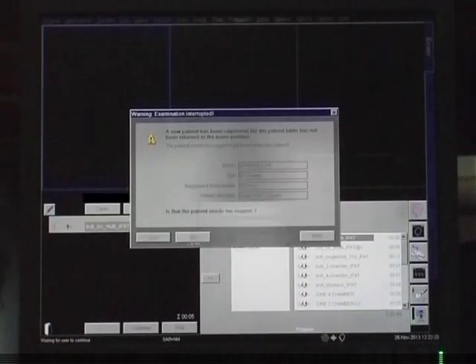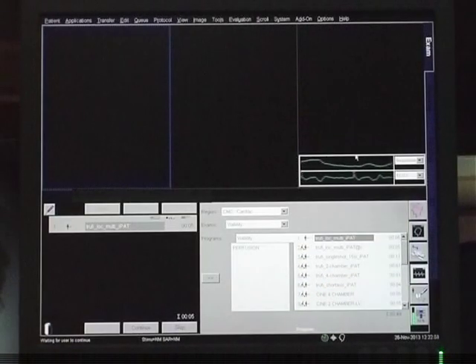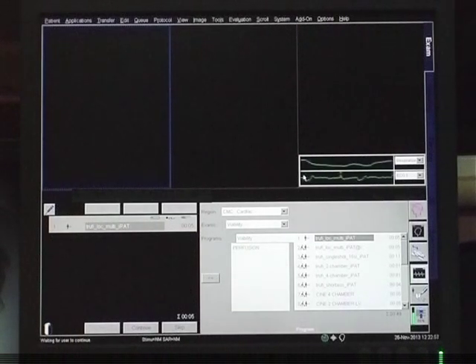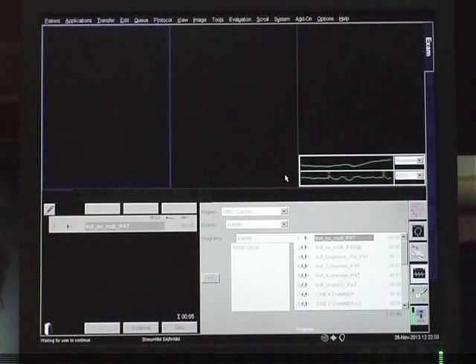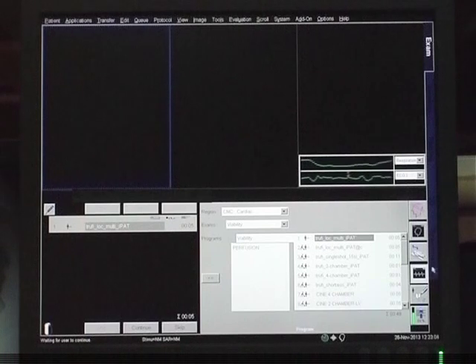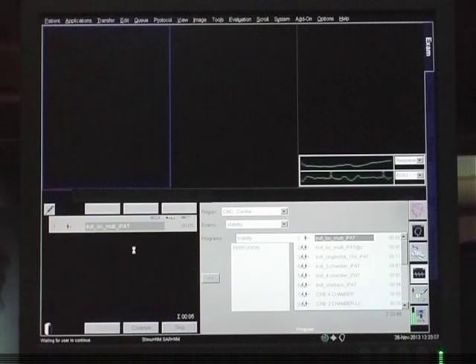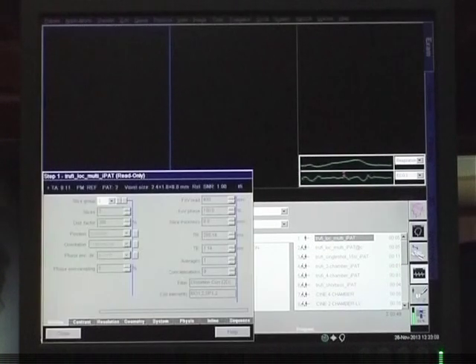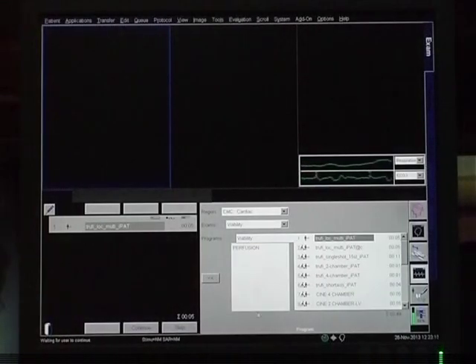Respiratory monitoring and ECG monitoring are performed. The ECG monitoring is done to look at the RR interval. There is distortion of the ECG by the magnetic field. If the patient is able to hold the breath, the study is performed with breath hold.